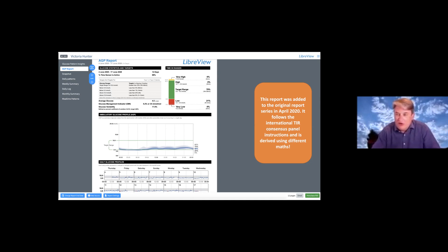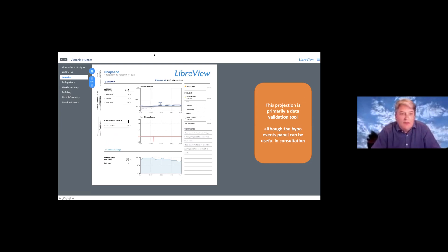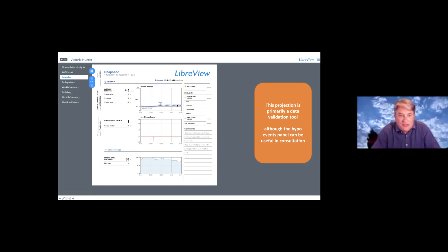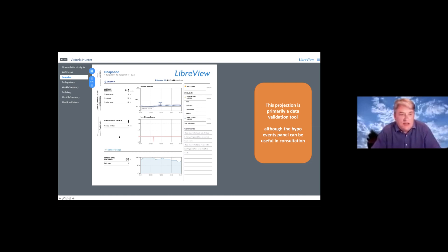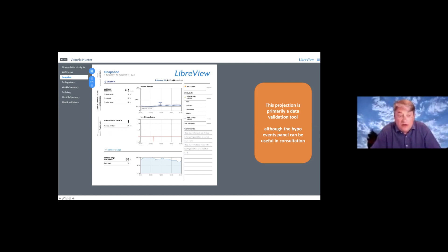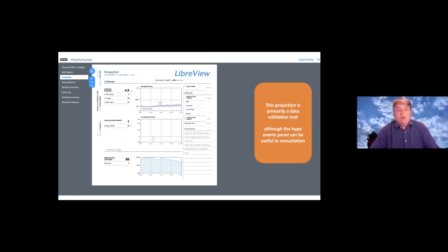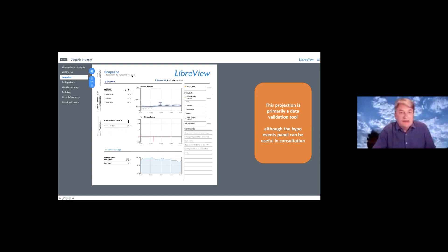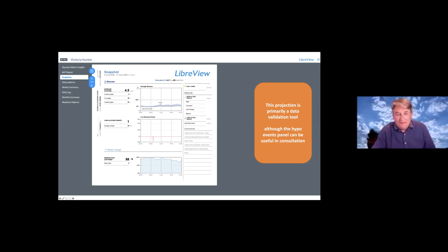The snapshot data gives you a number of things: a quick overview of what the AGP is going to look like — just with the 10th and 90th centiles — an average glucose level, percent in target range, percent below target range. Since this is someone without diabetes the numbers are as you'd expect. It can give you an idea of low glucose events — fixed at the below-3 event as defined on the program — and also how effectively the person was wearing the sensor over the two-week period: how much data was captured, and how many scans on average per day. This is primarily a screen used as a validation tool for the data.